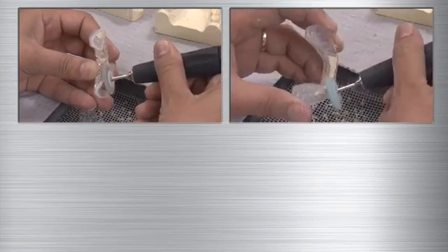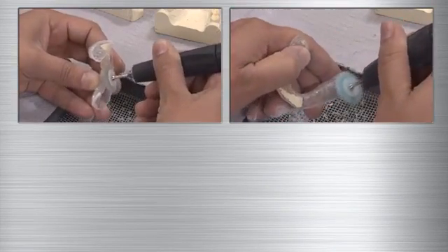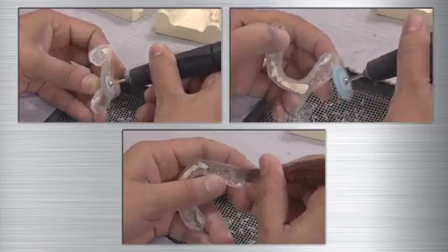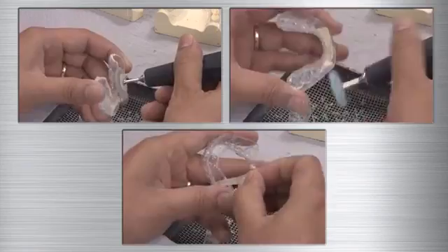Use the same steps of refining with the brown Lisco and finishing with the blue Lisco disc on the opposing tray. Remove the inner spacer and any broken teeth from the model with a knife.